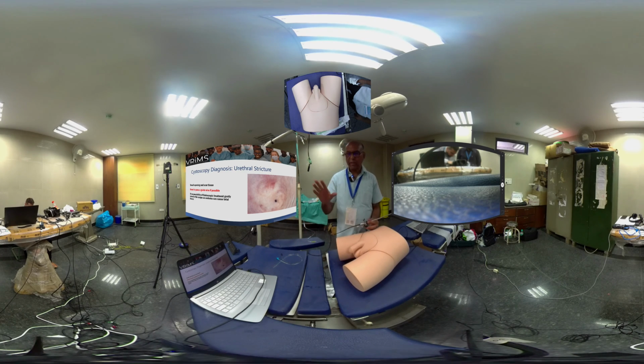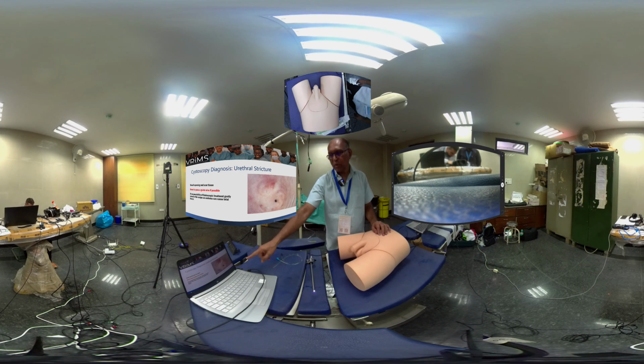So now we'll have a look at the, turn to your right and have a look at the slides. We'll show you some of the abnormal findings. What you see here is the stricture.